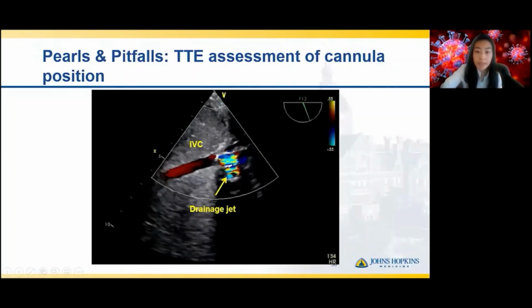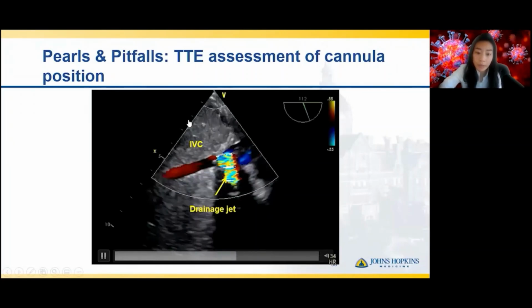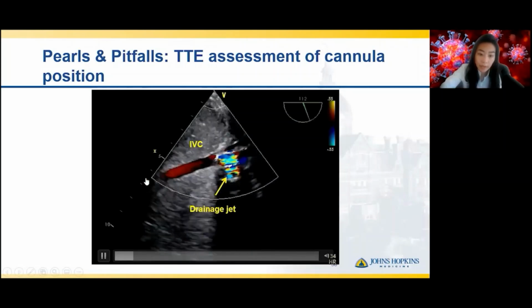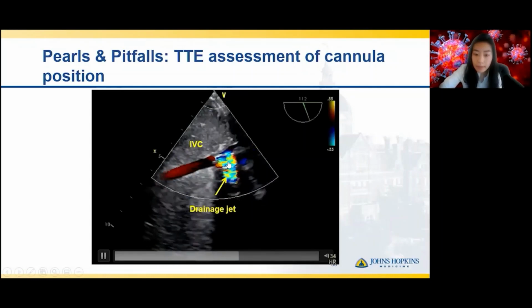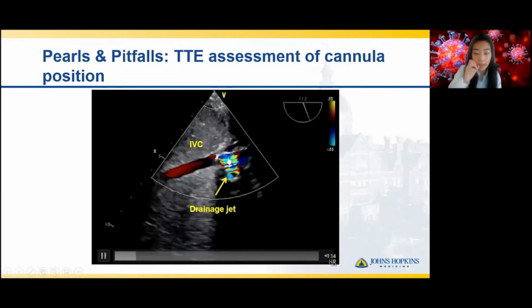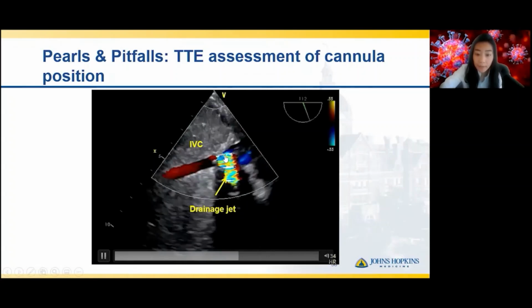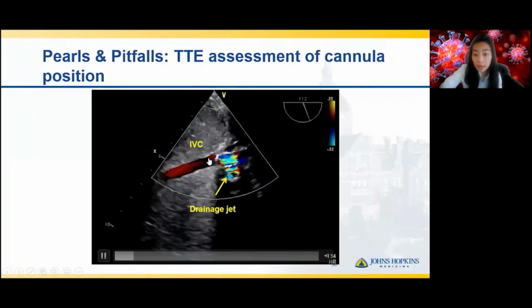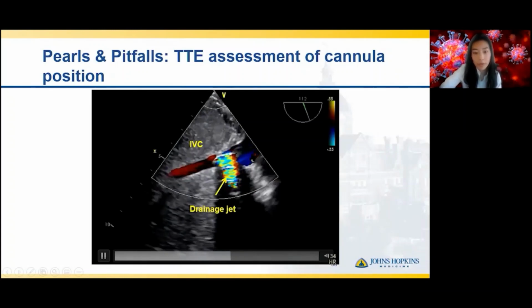And so what I've done here is place a transthoracic probe in the patient's subxiphoid area, and we are looking through the liver. This is all this tissue here, and specifically at the hepatic IVC running as a column across the screen here. And this yellow or blue flow, which is high velocity flow that represents the drainage through the cannula, is visualized within the hepatic IVC. And so there have been times when we can visualize both the cannula and the hepatic IVC drainage of the cannula under echo to continuously and in real time withdraw or advance cannulas that need to be repositioned. So a really important tool.